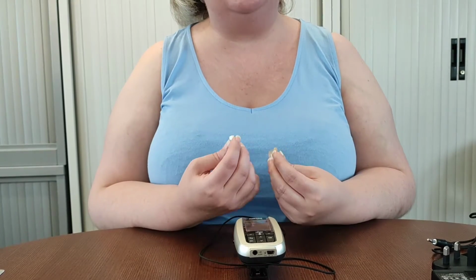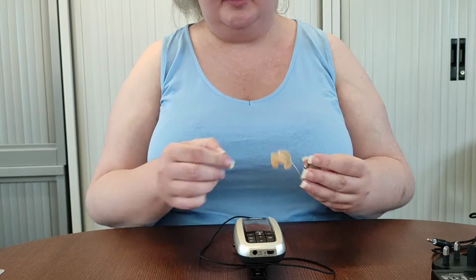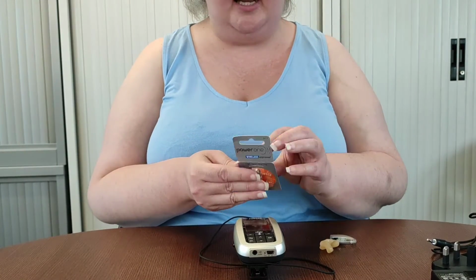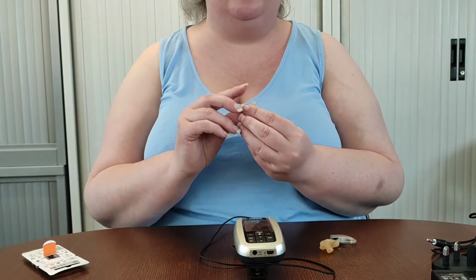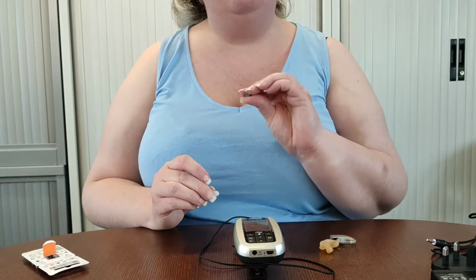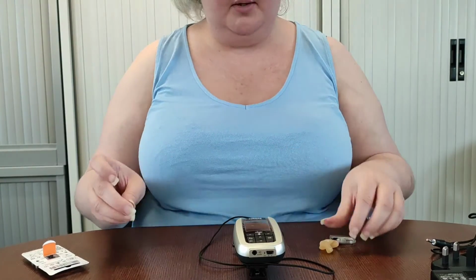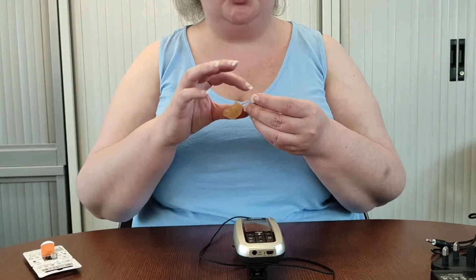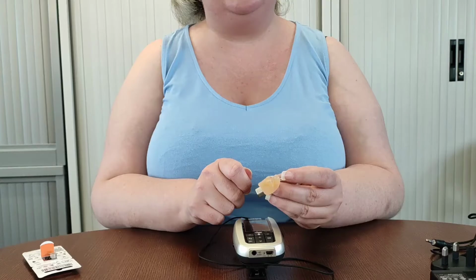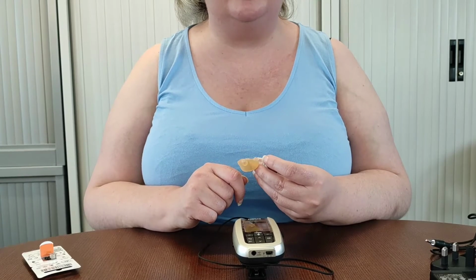Now, if those two things have happened and it's still not connecting, the next step would be, if you open the battery compartment, you can see you may have some spare batteries, or the learner themselves may have some, might be a different colour to these ones. But we need to take out a spare battery and we'll change the battery in the hearing aid or hearing device itself. So we're going to take off the sticky tab and we're going to leave it for 1 minute in the air before we put it inside our compartment. And once we've changed that battery over, we're going to do that process again. We're going to attach the audio shoe and make sure it's flush, and then we're going to try and connect again. Hopefully one of those two troubleshooting ideas will mean that it does say that it has connected.